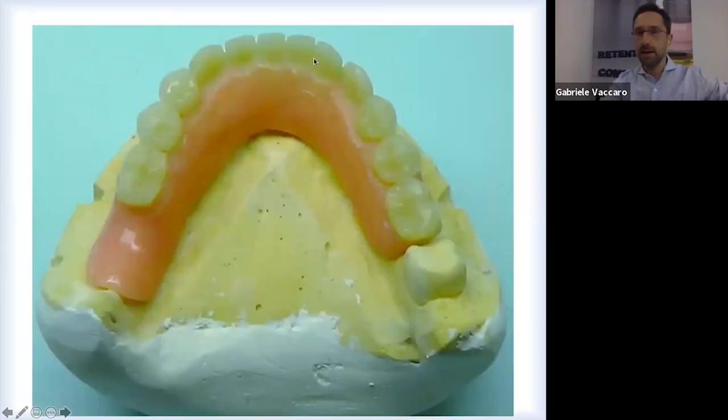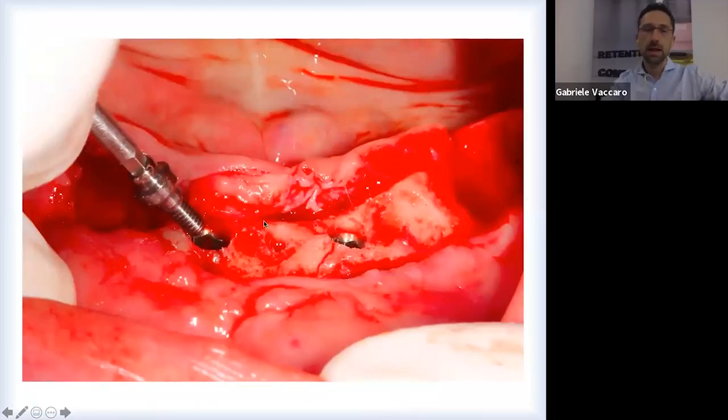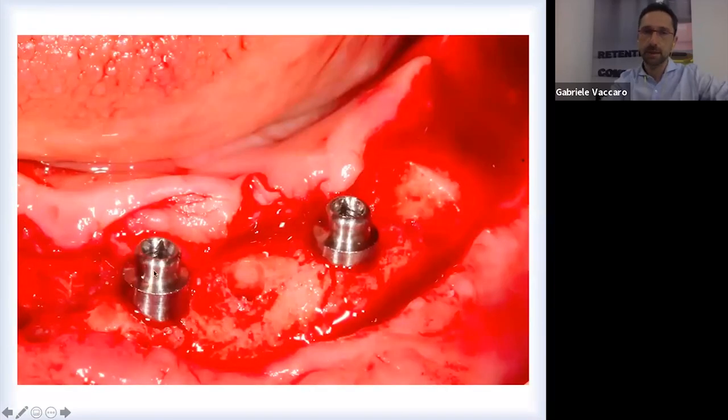This is the impression tray for the lower arch, exactly the same as we did for the upper arch. After we put the implant, we cleaned, you see some blood. After fixing the equator, it's important to clean the inside of the chamber, the hollow body of the implant, and then seal it once and forever.